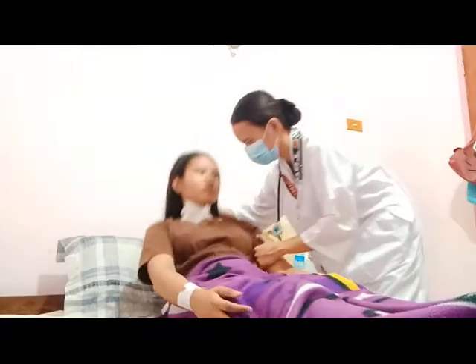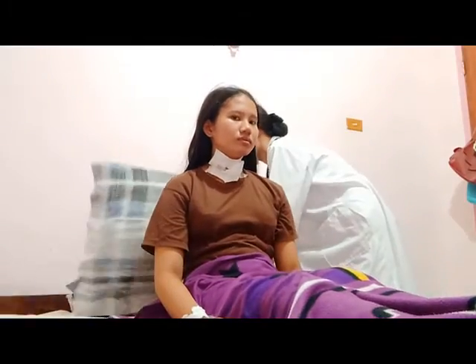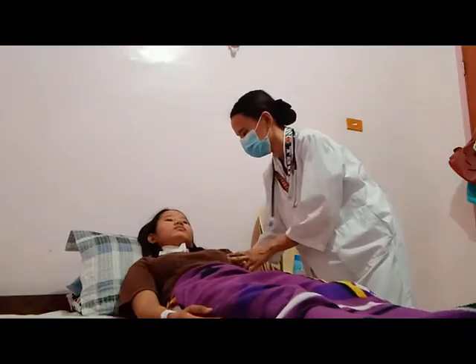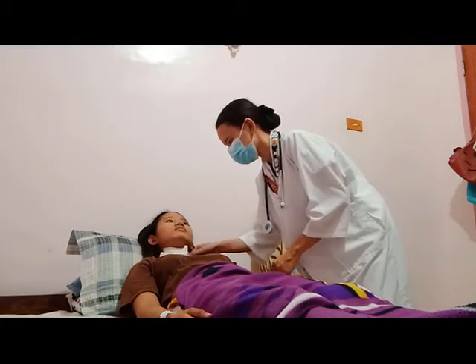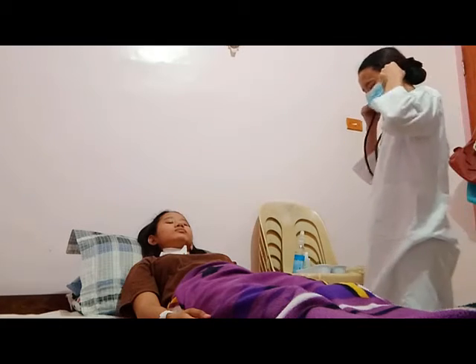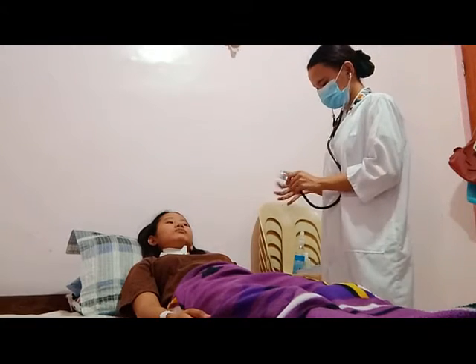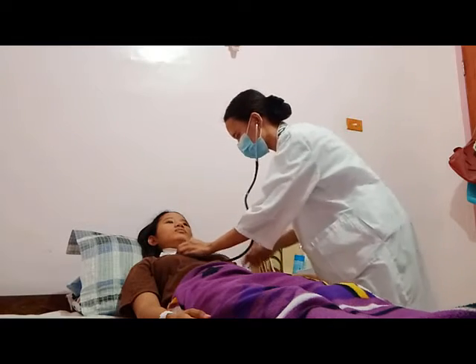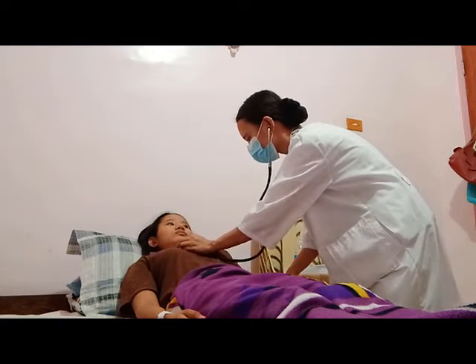Adjust the bed to a comfortable working position, usually elbow height of the caregiver. Lower the side rail closest to you. If the patient is able to tolerate it, place him or her in a semi-Fowler's position. Check for lung sounds.